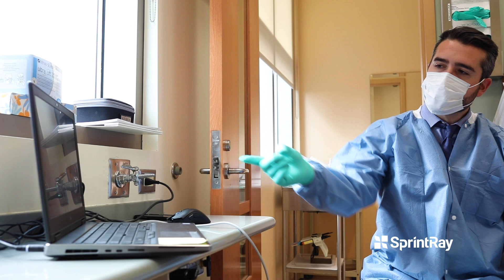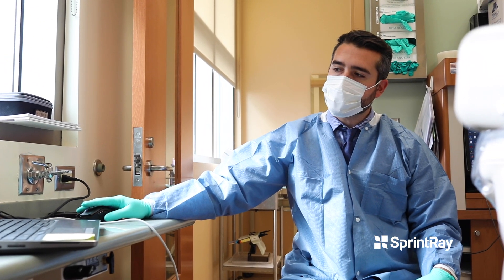For example, if we're scanning in the mouth and we're doing diagnostic impressions, that's great to see on the computer screen, but unless you actually have something tangible in hand to show the patient, it doesn't go a long way. So 3D printing is just critical to everything that we do — it's the seal at the end of all our digital workflows.